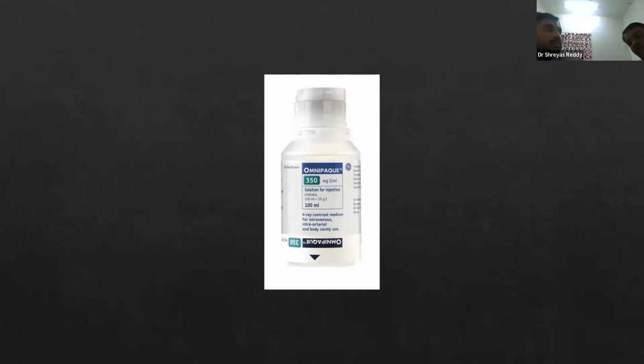So say a patient comes with a peripheral arterial disease and you want to do a peripheral angiogram, and the patient has deranged renal function. Patient is CKD. What is the one contrast agent that you will use for that patient? Do you know of any contrast agent that can be used for such patients? We can use CO2 angiography. You use carbon dioxide angiography.